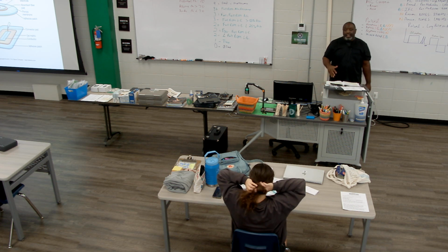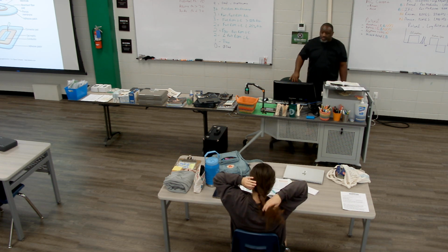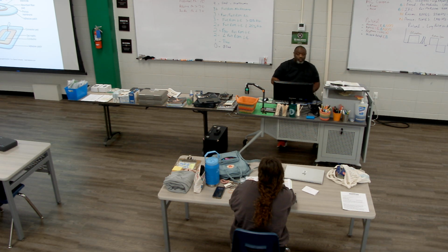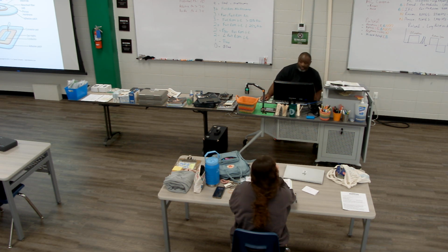You can buy a device that's designed specifically for that. It has a basin, and it will help with problems like hyperhidrosis, or sweatiness of the hands and feet. I don't know if you've ever met somebody who had sweaty hands, shake their hands and it's always wet, like, ah, that's gross. So if you do meet somebody like that, you may want to recommend iontophoresis.